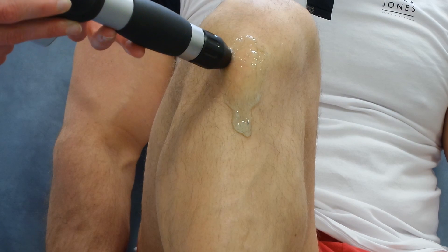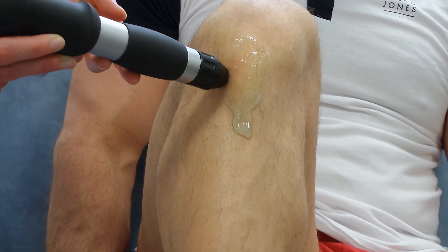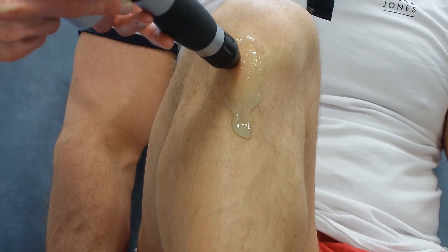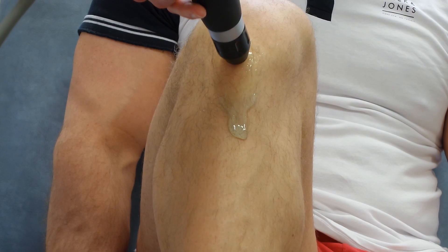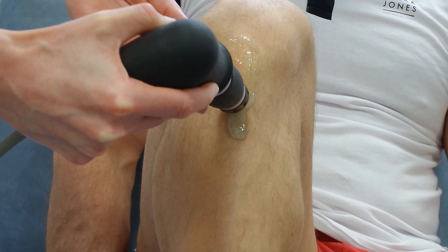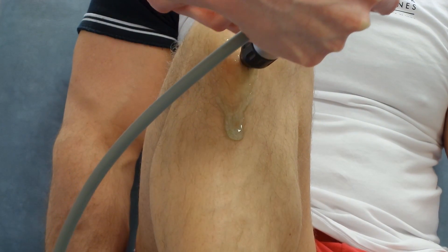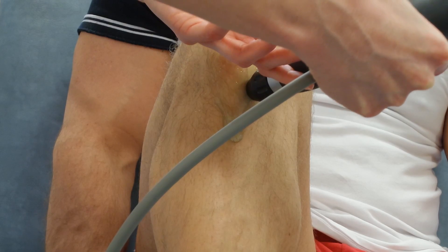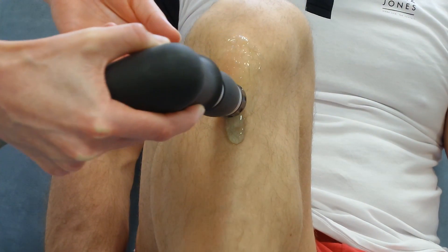Whilst other studies have shown that Shockwave actually gets rid of bone and makes bone smaller, which is what it is being used for here today and so should in fact make the Osgood Schlatter's better. Of course this is further complicated in children, as if Shockwave does encourage bone growth, you could end up with the growth plates potentially closing earlier than they should.